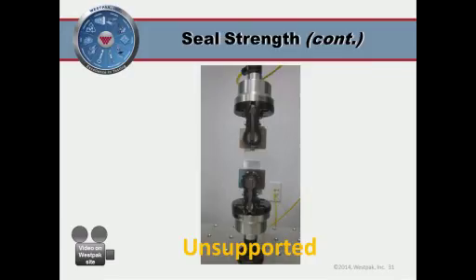So if the bottom one tends to be more integral, maybe 3 pounds per inch or 10 pounds per inch, if it's intended to be that way, so be it. There's no rules to say it has to be one thing or another, but they should in fact be consistent. That's the important thing. Katie?